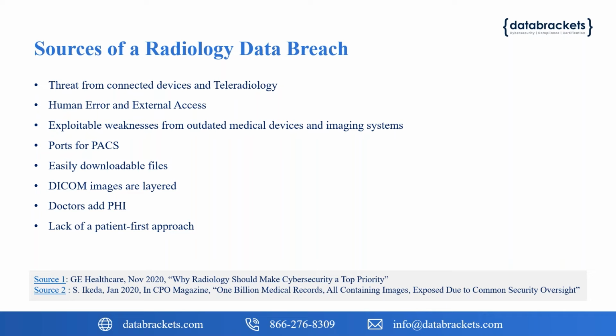And then that third one here is a very interesting one. Most of these medical devices are produced by a few vendors in the industry, and they all use pretty standard images to create the machines, and they either use some kind of open source Linux-based operating systems or Windows-based.